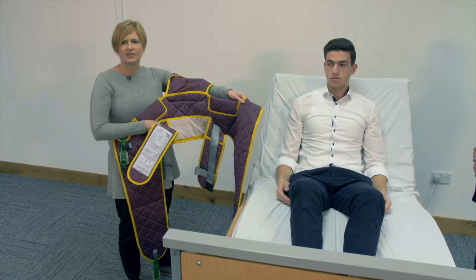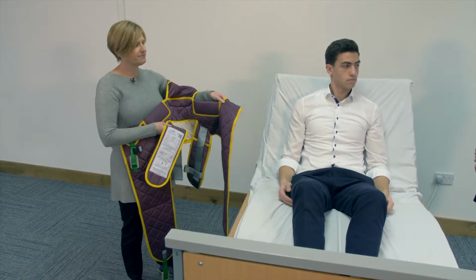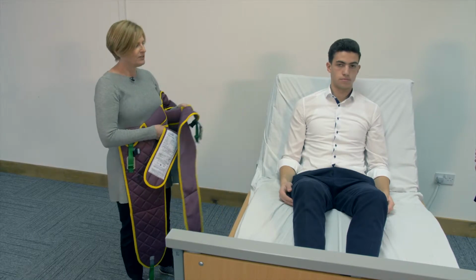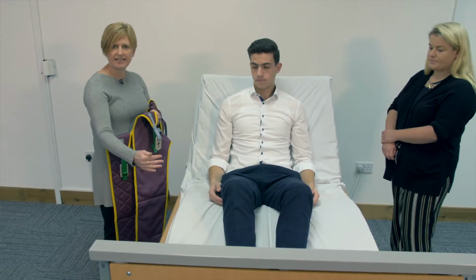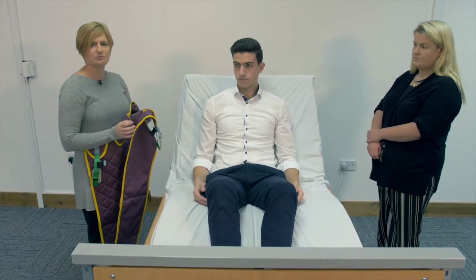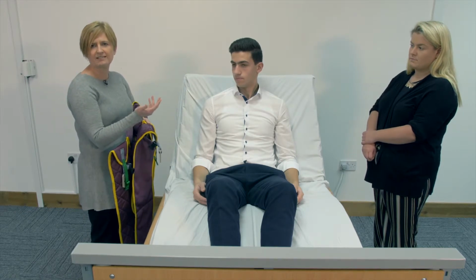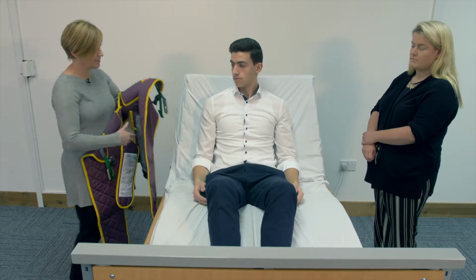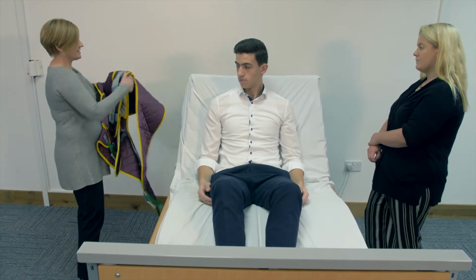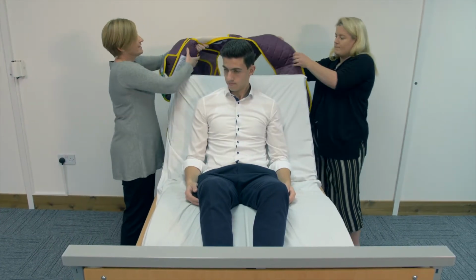This is an Alto Clip-fit Toileting Sling, and we're going to show you how to fit it in the bed. We've profiled the head end of the bed up and the knee break, because if somebody's suitable for a toileting sling, then they should be able to sit forward from the bed adequately for us to fit the sling behind the person.